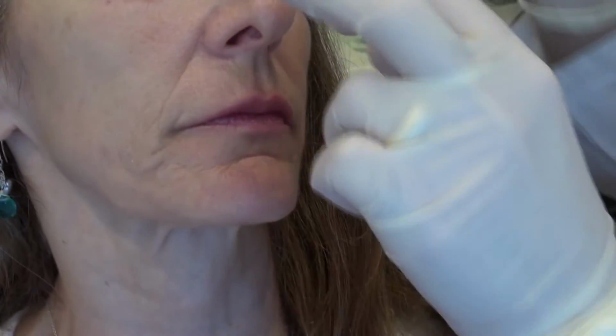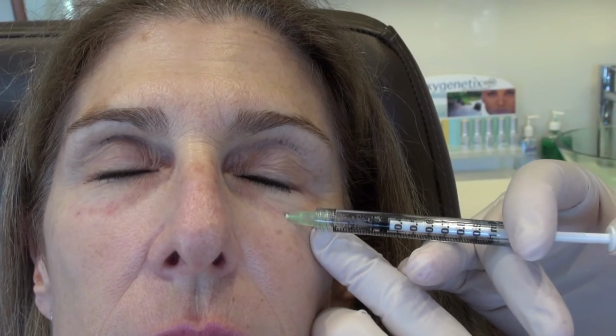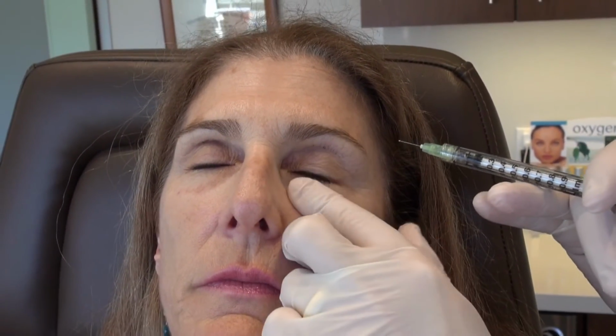Let's turn this one. Okay, little stick here. And I always know where that orbital rim is. I'm always palpating it so that I know that I'm in a safe place. Open your eyes. Stick here. And I'm injecting very little bits each time. 0.1 cc, 0.2 cc max. Usually it's about 0.1 cc per injection.